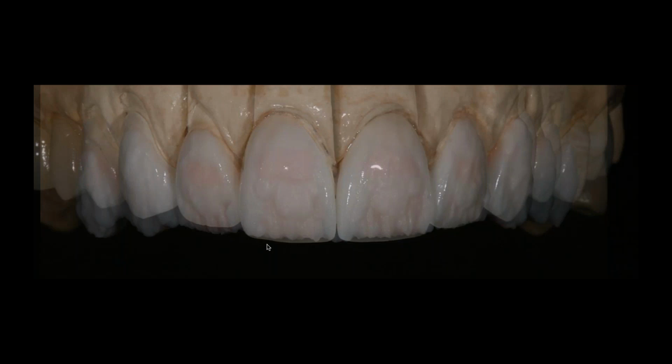So when I'm looking at cases and I'm trying to pick shading for teeth, I'm usually starting by looking at the enamel. Is it a really translucent enamel that I'm trying to match, or a more opacified whitish enamel that I'm trying to match? And today that's challenging because a lot of the patients are bleaching before you get to see them, and the enamel kind of seems a little more frosty than you'd actually like it to be. But in the end, this effect is similar.